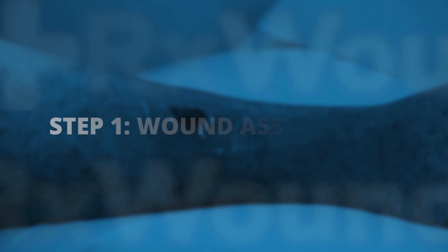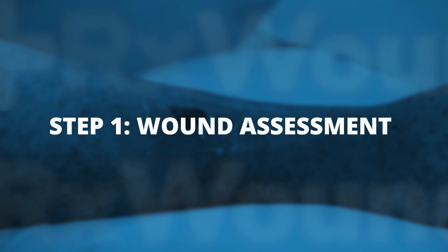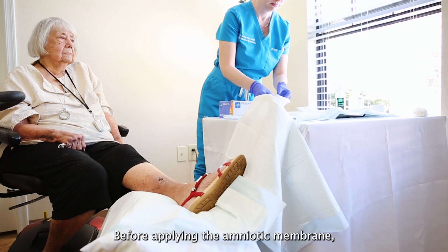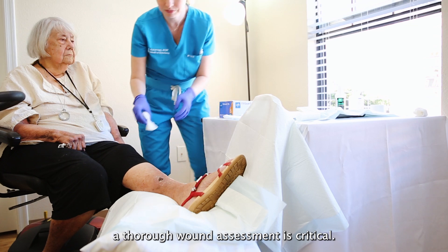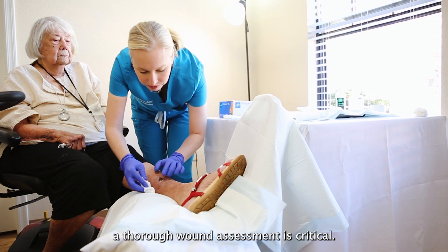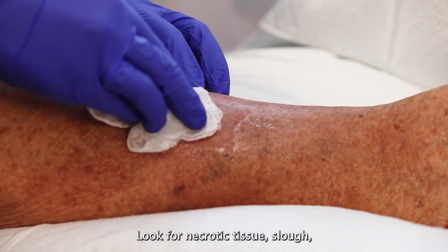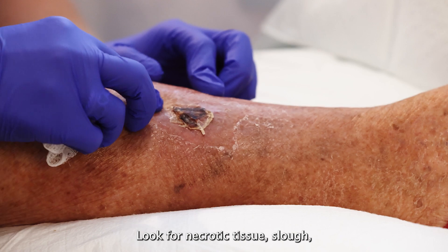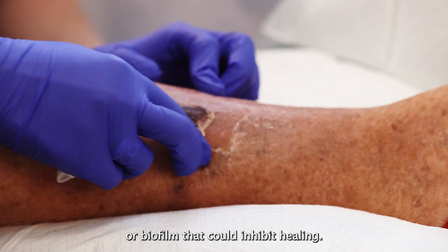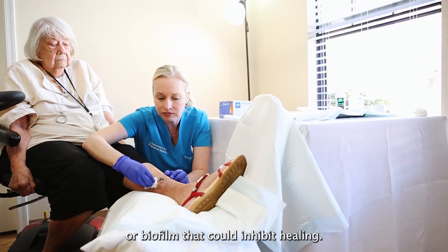Step 1: Wound Assessment. Before applying the amniotic membrane, a thorough wound assessment is critical. Look for necrotic tissue, slough, or biofilm that could inhibit healing.